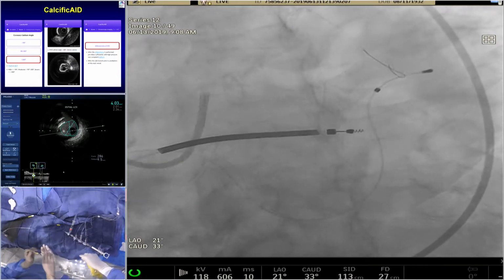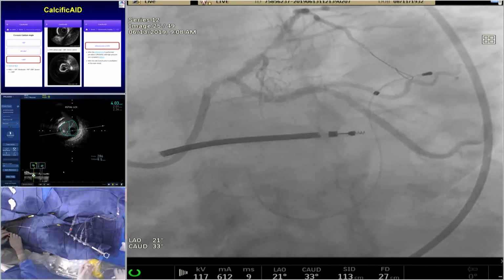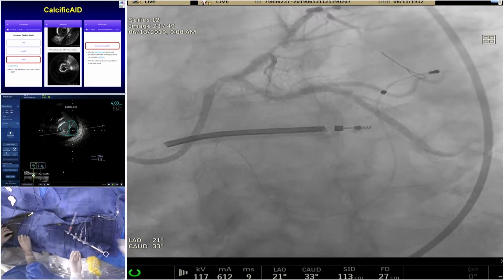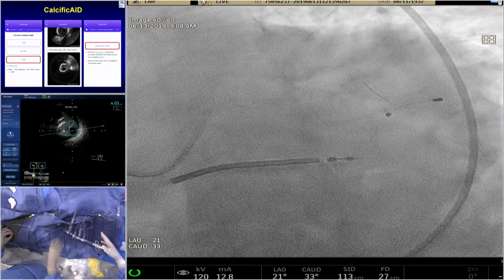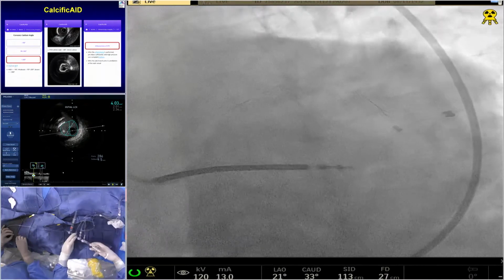You would go for circ and do a mini crush type of situation? No, no, I will do provisional. This is my only technique. Your only technique is provisional, Doctor? But provisional is the wrong name. Of course, we may have to put two stents, but my first step will be a crossover from left main to circ.